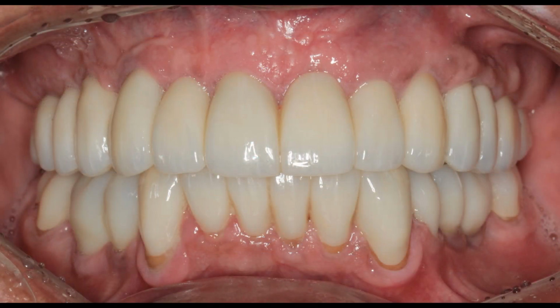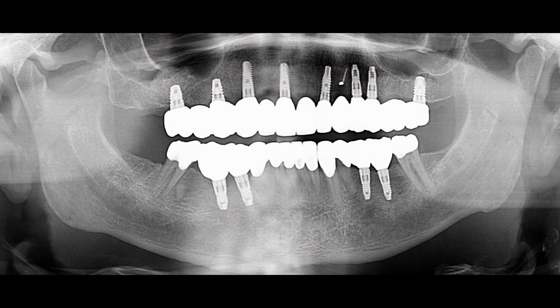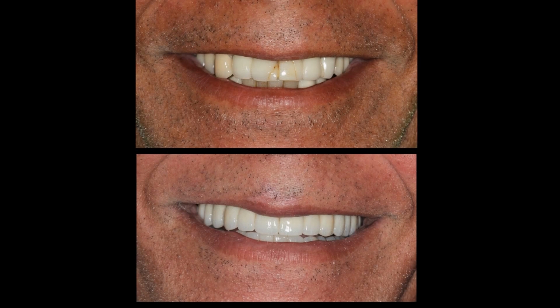Here's his final restoration. He has a full upper zirconia bridge. On the lower, he's got zirconia implant crowns and natural tooth crowns. Here's his final panoramic x-ray. Before and after smile.